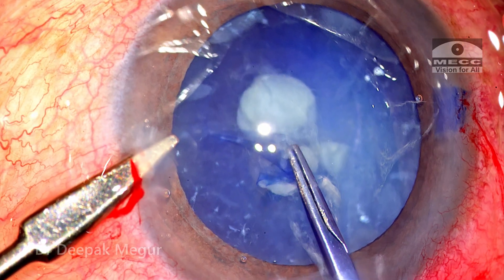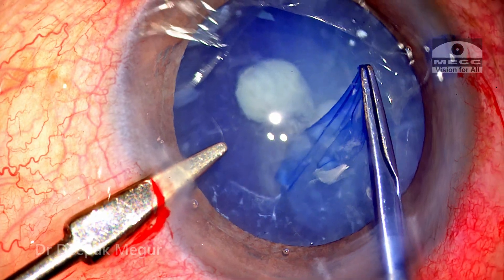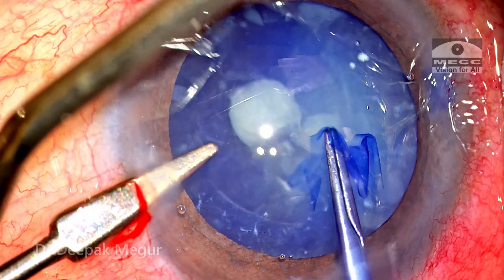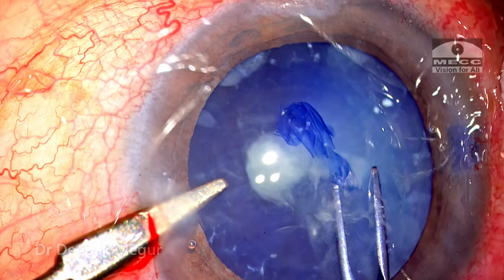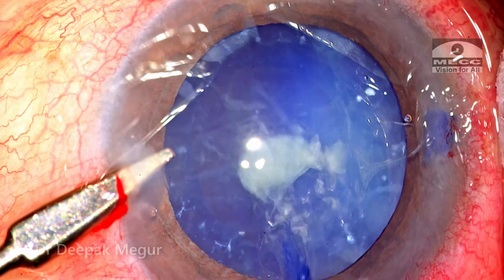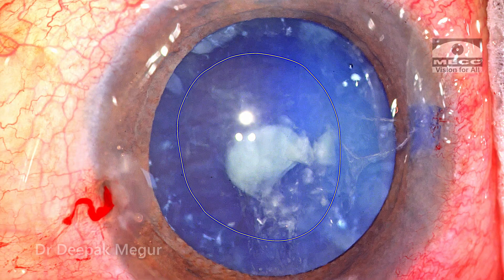As the rhexis is being done, I'm very watchful, trying to find out if I can see any folds on the anterior capsule, which could suggest significantly weak zonules. On the contrary, the tearing was reasonably good and there was a lack of any visible folds near the cutting edge of the flap, suggesting that zonular health seems to be all right. Eventually, a well-centered and appropriately sized rhexis could be achieved, even though visualization was not great.